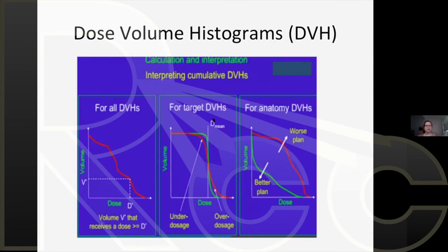Frank, maybe you can also speak to the topic of, if you've got your coverage and you have to choose between two plans with DVHs, where one has a much lower maximum dose for the OAR but more low dose to the OAR, versus a plan that has a similar gradual fall off but has a much higher maximum dose to the OAR. What sorts of considerations would you keep in mind when picking the better plan in that case?